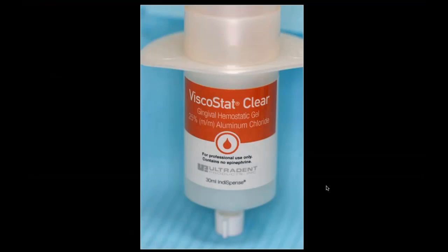I choose to do the putty first with a wash, and you will probably get a better marriage between those. But you can do it that way.